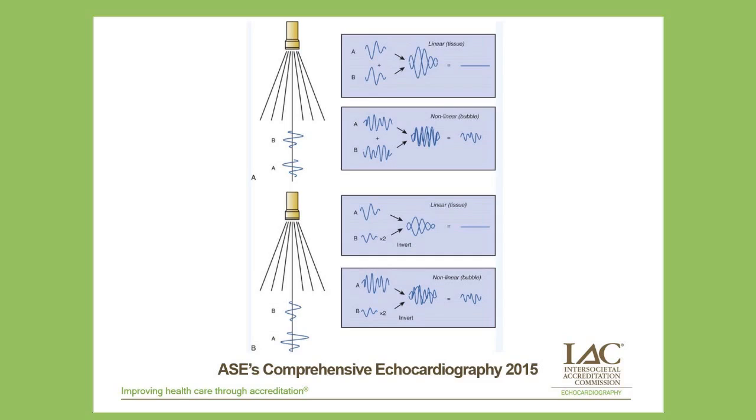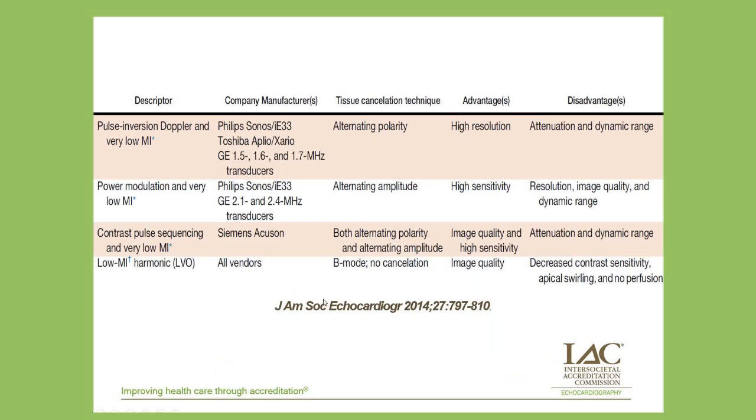And what's unique about this is that we can detect both the fundamental frequency and the harmonic frequencies of this, so that we get a much more robust signal from the microbubble at this very low mechanical index, while having built-in background subtraction. What does this look like?